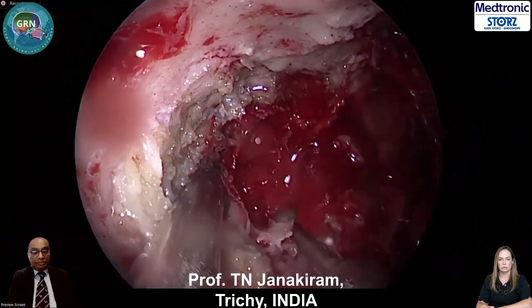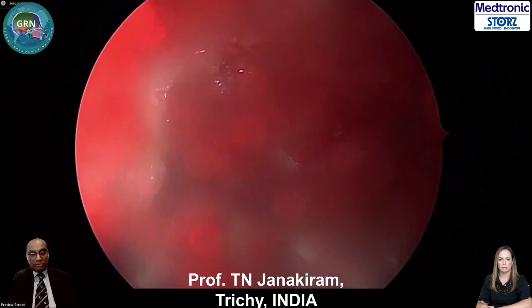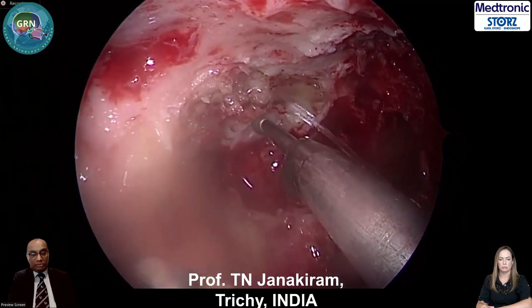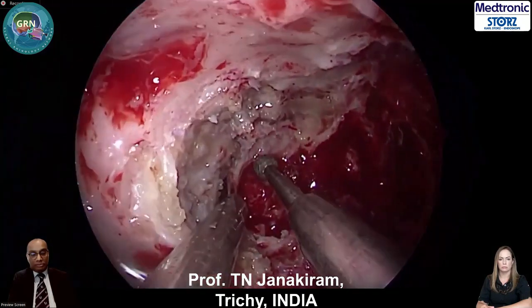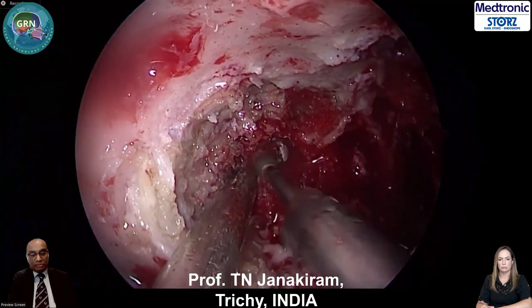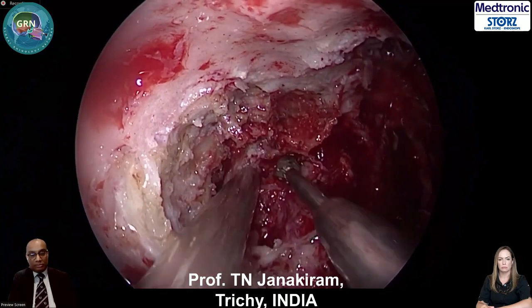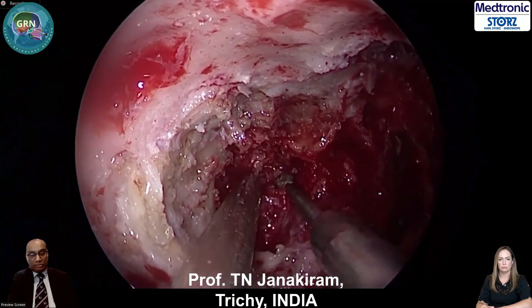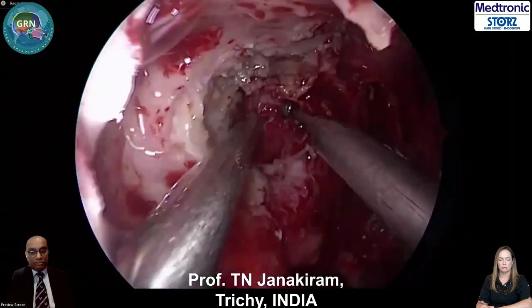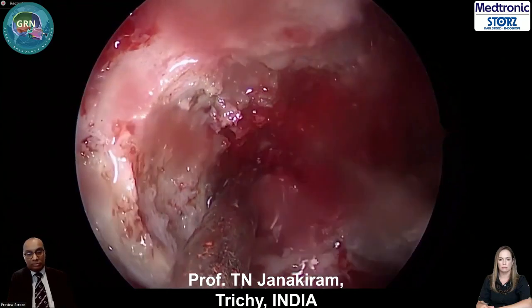I'm just exposing that JNA in the transpterygoid space. Go closer, my dear friend. Irrigation increase. Increase.